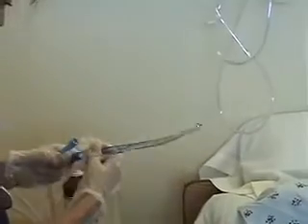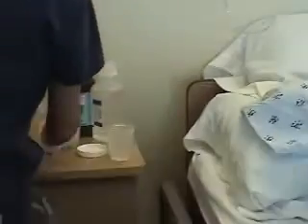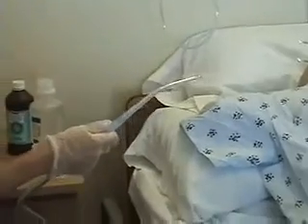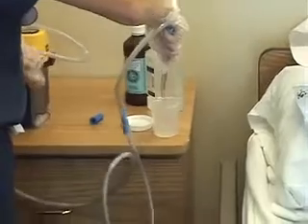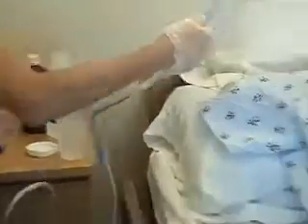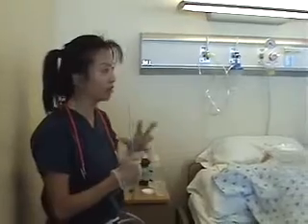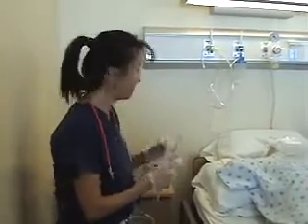You want to see if it's working? It is working. Then you want to suction the patient on the side. And sometimes if you want to get rid of all the fluid, what do you say? You tell them to kiss the tube. Then you can basically get everything out of the mouth, right?